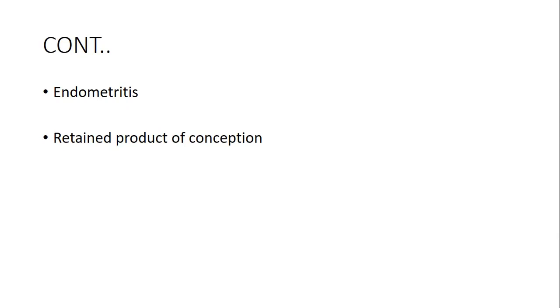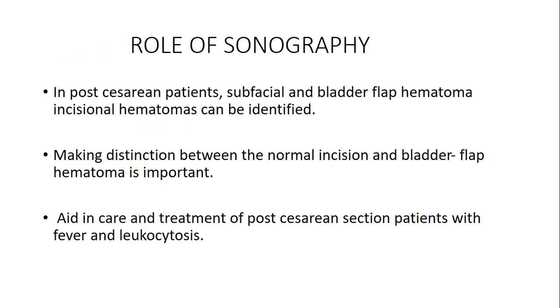You can mention there are echogenic contents within the endometrial cavity, approximately this much, so that they are aware. The patient may be bleeding.